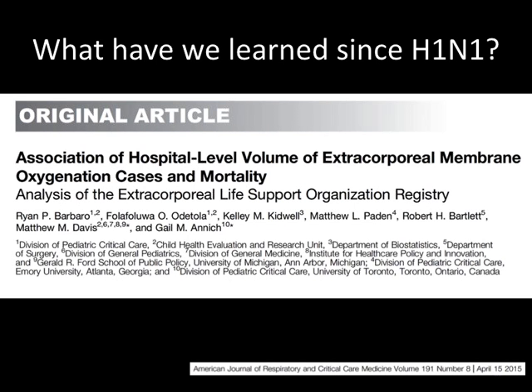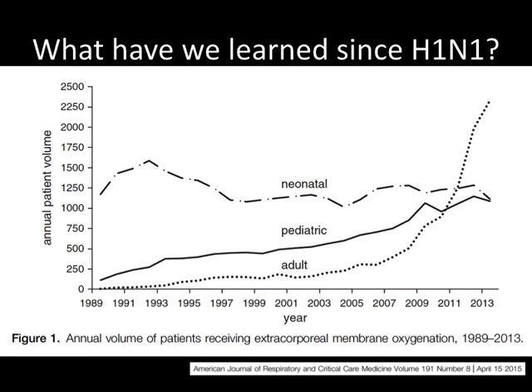So since H1N1, what's happened? Well, this is the most important thing that's happened of late. First of all, the use of ECMO in the adult population has absolutely caught on fire, 10 times the use in the last 10 years of ECMO in adults, going from a few hundred cases a year to a few thousand.